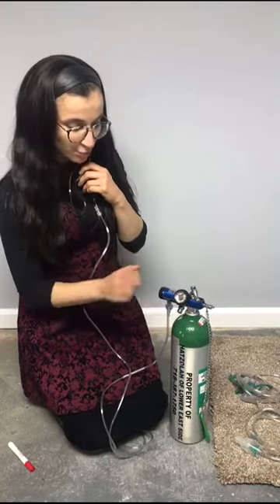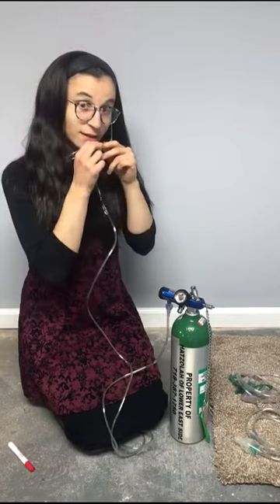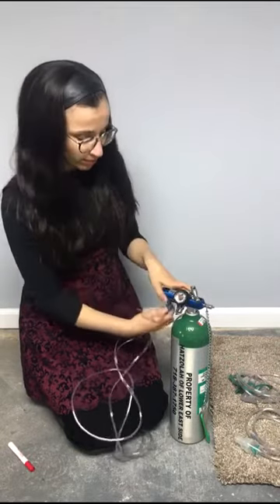And then you're going to titrate it. Usually it's on the wall. It's going to say 2 liters, 4 liters, 6 liters, whatever you want to go to. And the oxygen goes in through the nose. So remember, with the nasal cannula the patient can breathe by the mouth, they can eat, very comfortable.